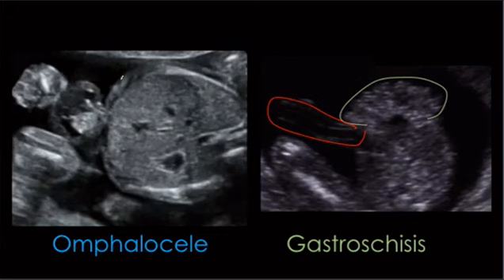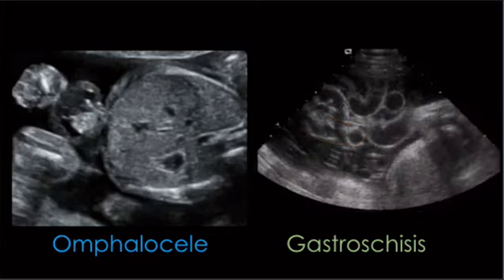So remember I said that this is the more common way to show this. I think that gastroschisis is more likely to be shown like that. And the reason is it's like, oh, it's obviously a bunch of bowel, right? There's bowel outside of the body. It's clearly bowel. There's nothing else that's going to be. So it's a slam dunk, so it's easy. It's fair. Let's not say it's easy. It'd be fairer to ask it like this, and it would be more fair to ask it like that. But that's another way that they could show it.